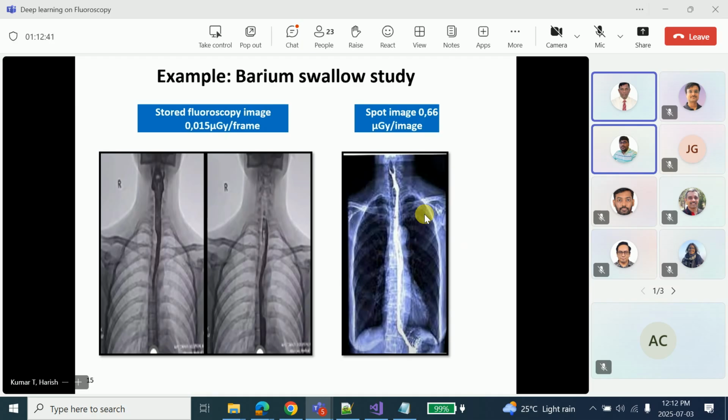That is also possible. But when you do an MR or a CT scan, the entire region of interest can be captured as a single shot, with multiple frames where motion will be captured. Here, we need to move it part by part, because sometimes we are not able to continuously and quickly move the system down. It is for better capture, better visualization and detailed information. Because we are not dealing with CT systems, only radiographic fluoroscopic systems.